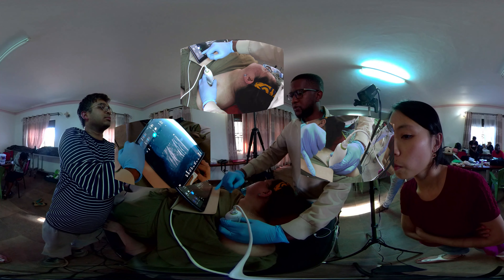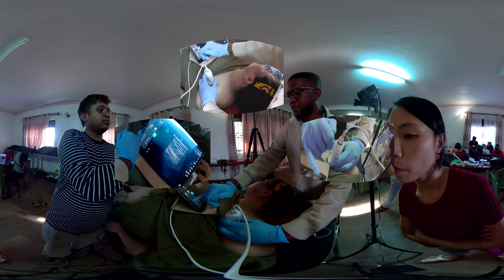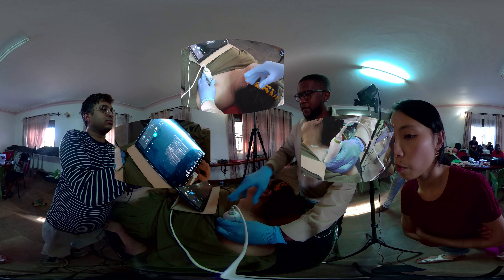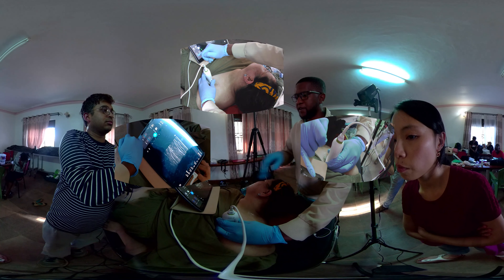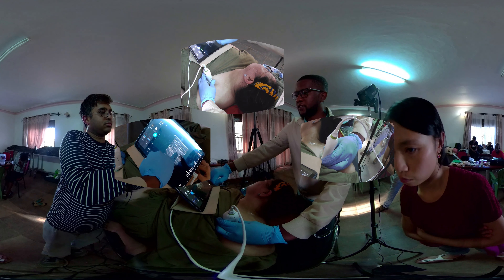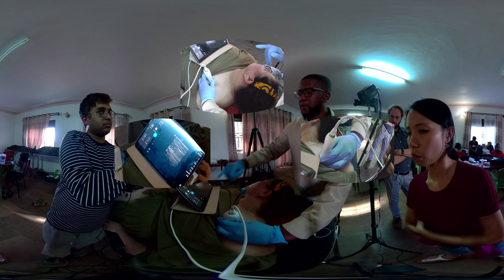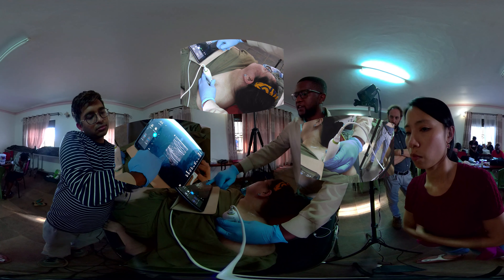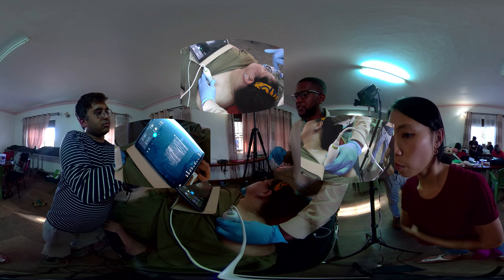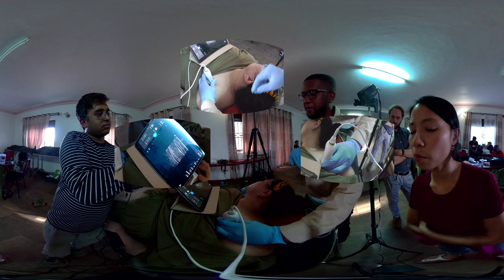In this case, we need to increase the depth a little bit and add a bit of gain. You have a classic appearance of the pec major, the most superficial muscle, and deep to that the pectoralis minor. And you have the subclavian artery, which is evident as a pulsating artery right below the pec minor.